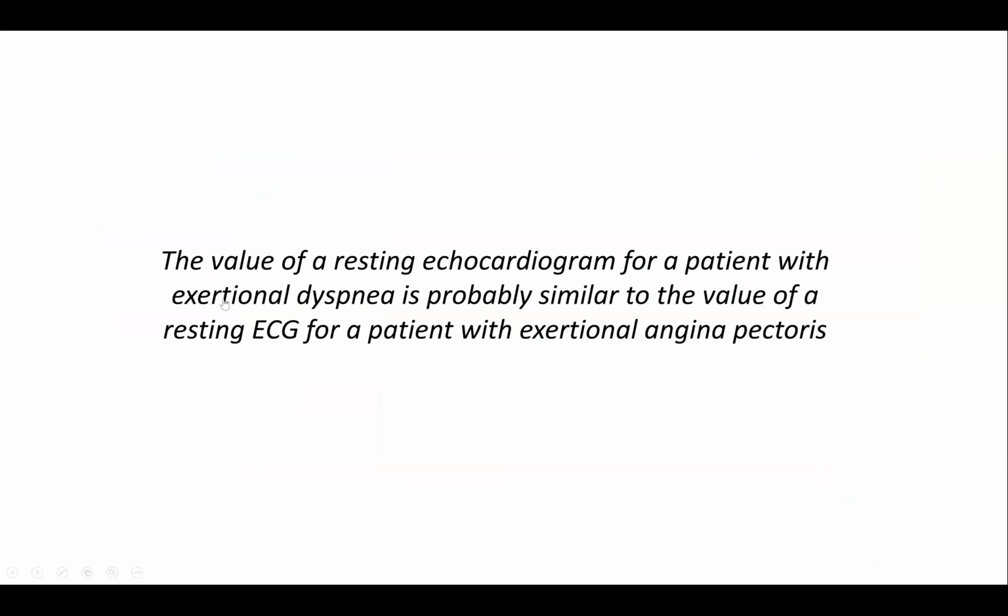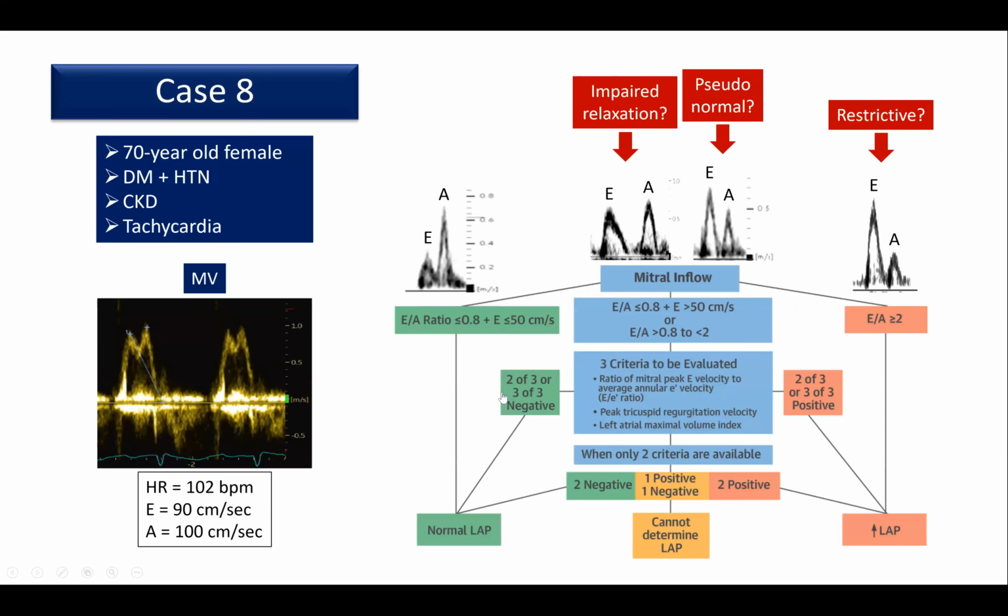And this is what I wrote here. I wrote that the value of a resting echo for a patient with exertional dyspnea is probably similar to the value of a resting ECG for a patient with exertional angina pectoris. I mean, a patient having chest discomfort sounding like angina pectoris, what is the value of a resting ECG? It has some value, but not really much. You really need, in patients who have exertional dyspnea, to do a stress echo.